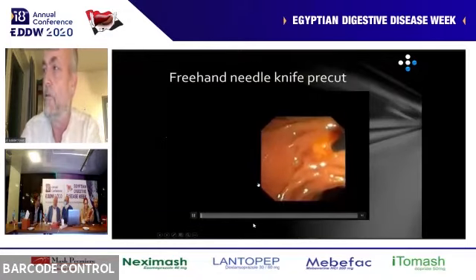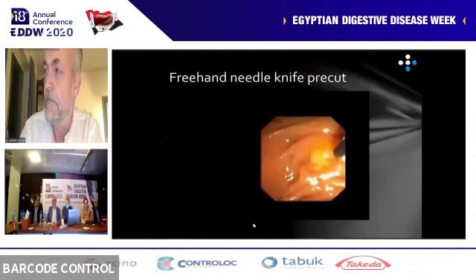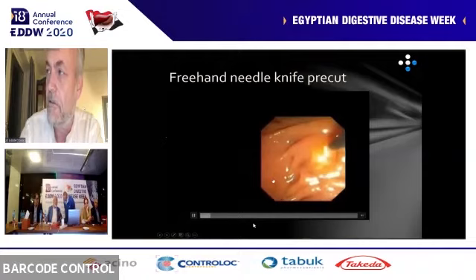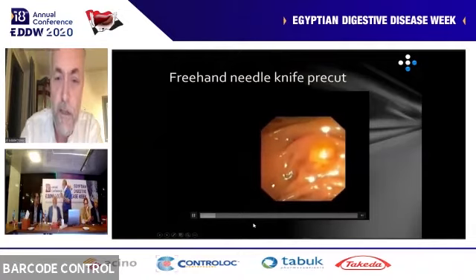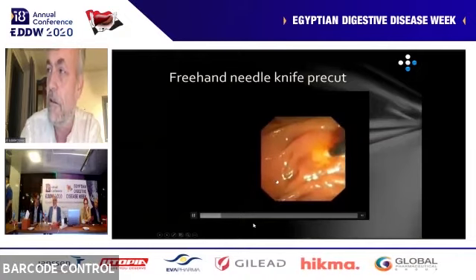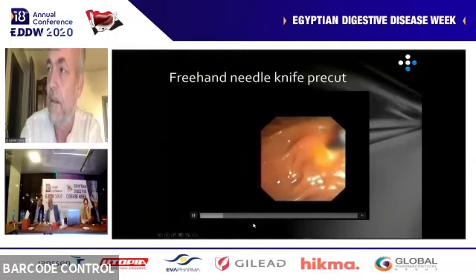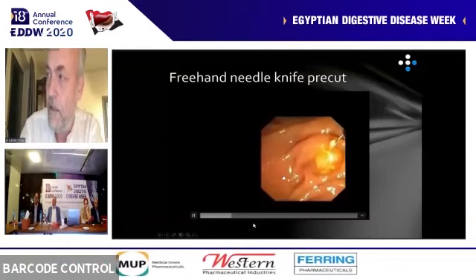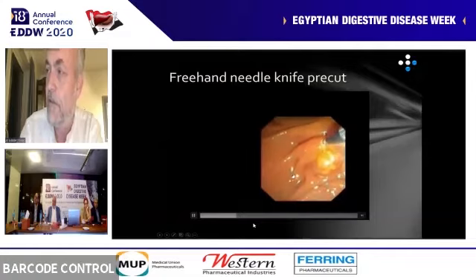But if you do it, this would be the idea. You pre-test the angle of the cut. You insert the needle into the orifice. At least that's what we do. And then pass upwards, ideally along the plane of the bile duct, and then layer by layer try to approach the level of the bile duct.